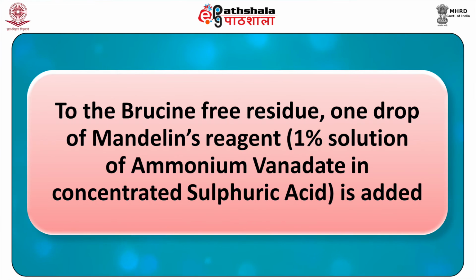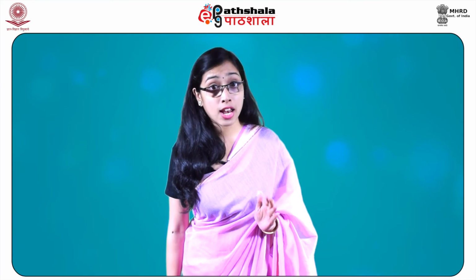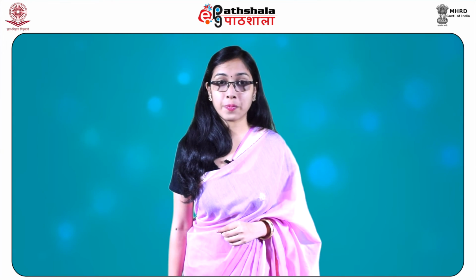Next is Mandelin's test. To the brucine-free residue, 1 drop of Mandelin's reagent, that is 1% solution of ammonium vanadate in concentrated sulfuric acid, is added. A deep violet blue or deep purple color appears, which finally changes to yellow on long standing, indicative of the presence of strychnine.